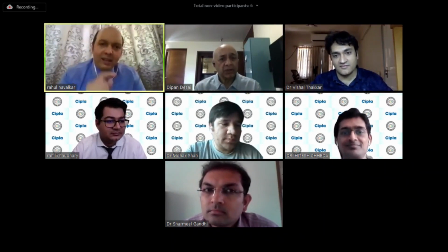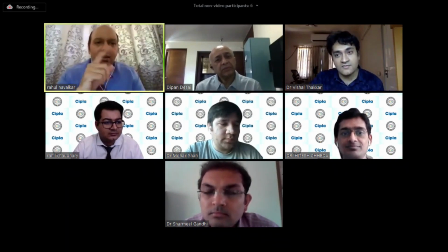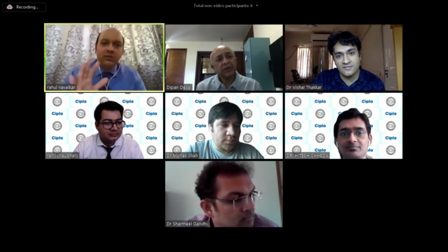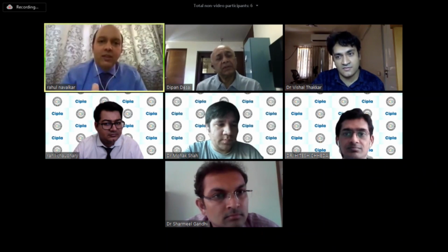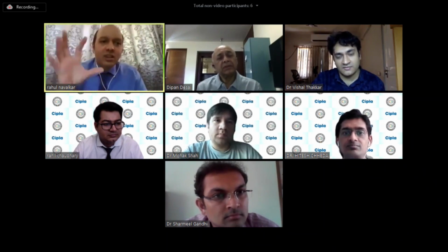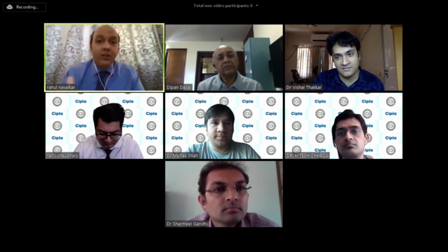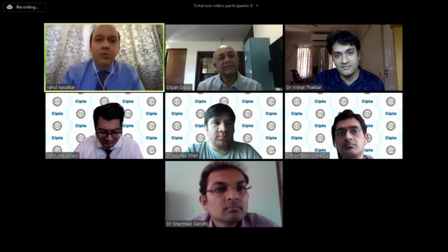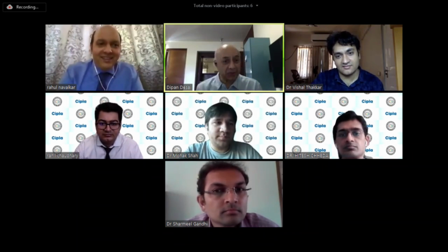I would like to add one thing which sometimes I follow, suggested to me by a friend of mine, Dr. Rishi Swarup: in RK patients, you take out the cataract, leave the patient aphakic, and go in as a second procedure after the refraction. I know it sounds like too much, but the accuracy and predictability is much more than trying to estimate something. Rishi has very good patients over there.